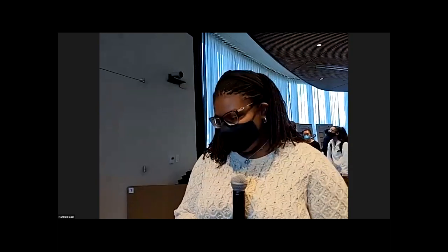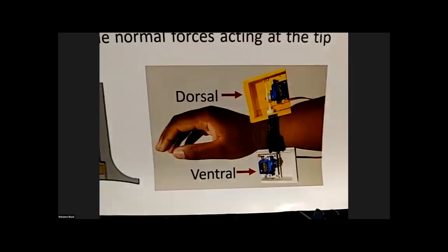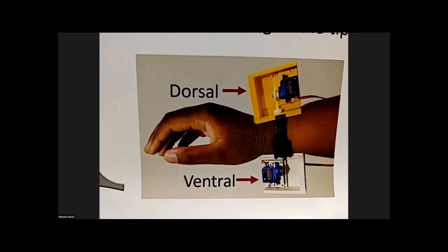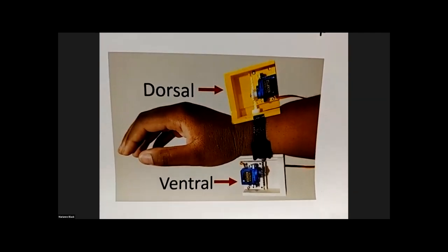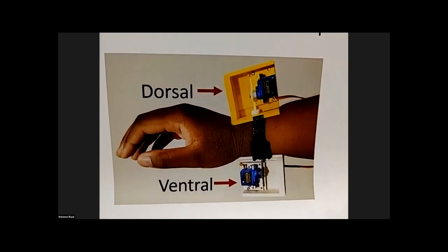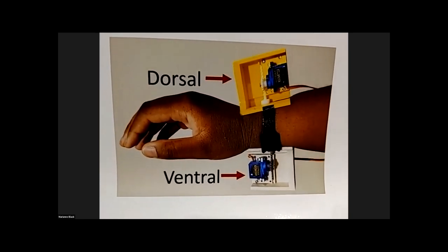Do you want to tell us about your equipment down here and what it does, just for people who are unfamiliar with these technical components? Yeah, you might want to look at the device design section for the camera. That might be the easiest to see. So yeah, I have two 1 degree of freedom devices. There's a tactor that's actuated by what's called a rack and pinion mechanism. So there's a small servo motor that just rotates, and then it's connected to the tactor, which then allows you to push into the skin.